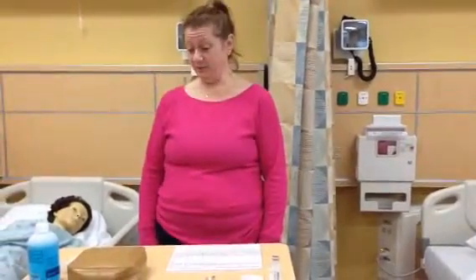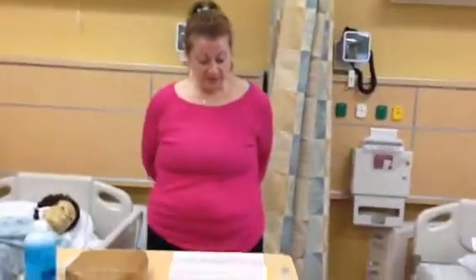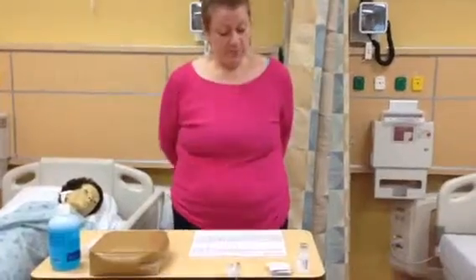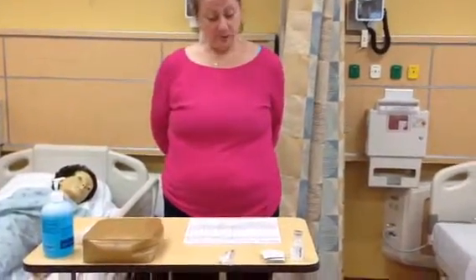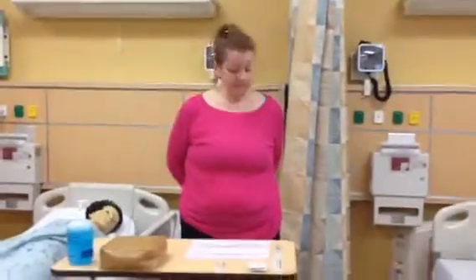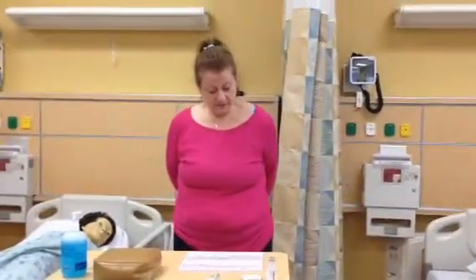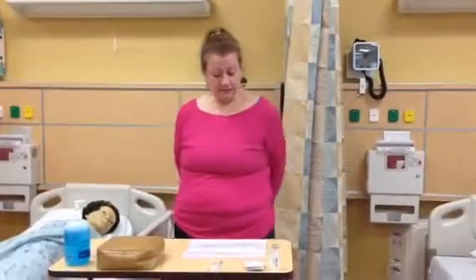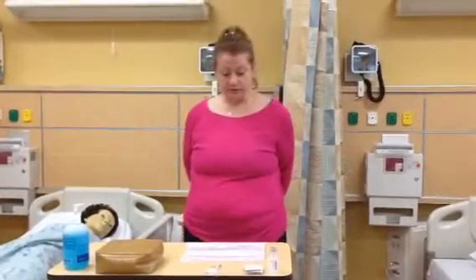Today's injection will be an intramuscular injection. My patient Mary Smith will be getting Vistaril for her moderate anxiety. I will go in and check with my patient to see what her anxiety level is. She has several different choices for her Vistaril, from mild to severe.